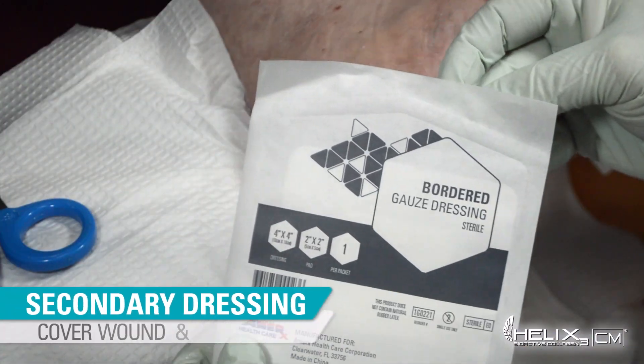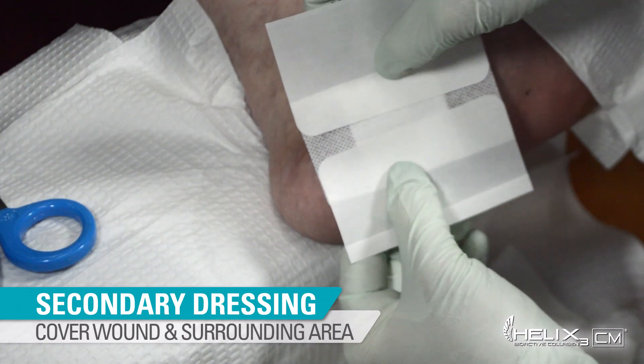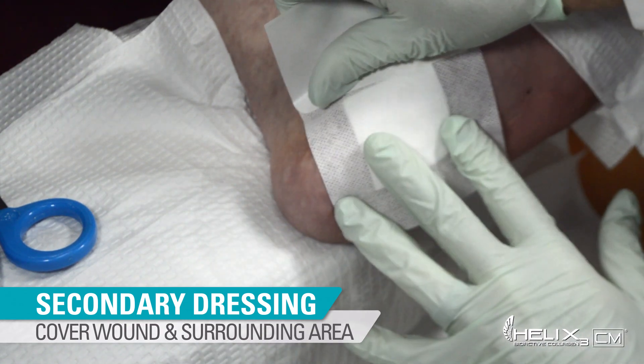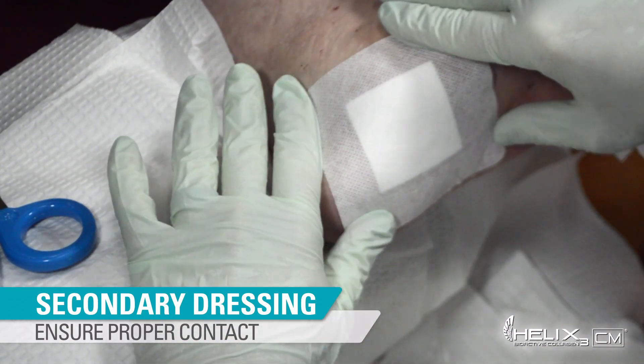Once applied properly, use the self-adhesive Amerix bordered gauze dressing to cover the wound and surrounding area. Carefully smooth the edge of the dressing to ensure proper contact with the surrounding skin as the final step.